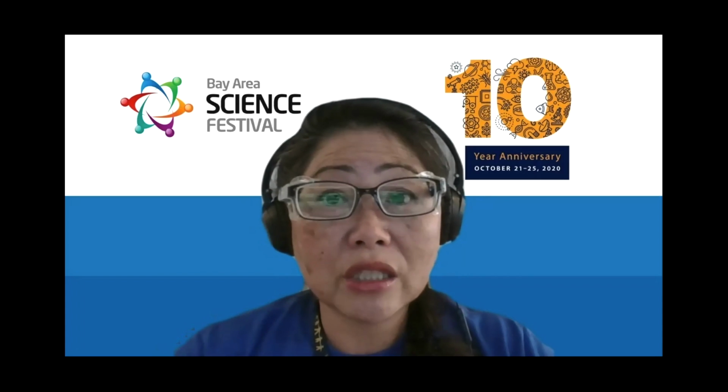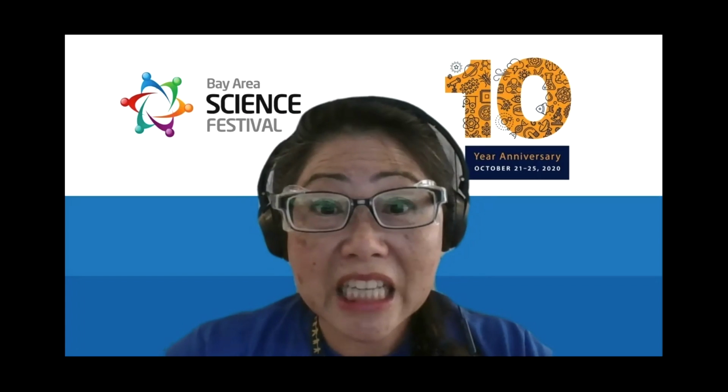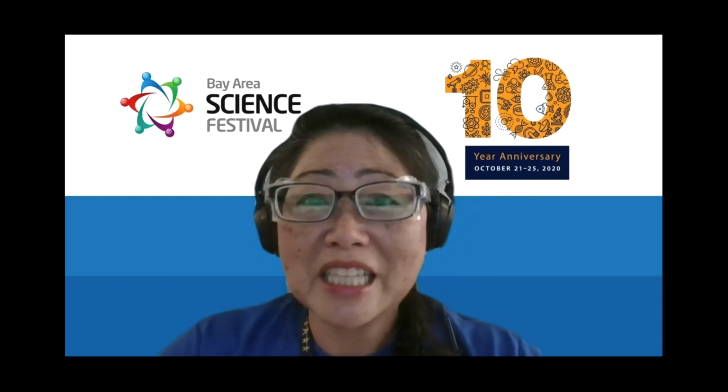And way back when I first started working in the lab, one of the first things I learned was tissue culture. So that is in the beginning of this session. We'll show you a couple of videos, one in English, hosted by my friend Sumi, and one in Spanish by my friend Carlos. And they're about 6 to 7 minutes apiece.